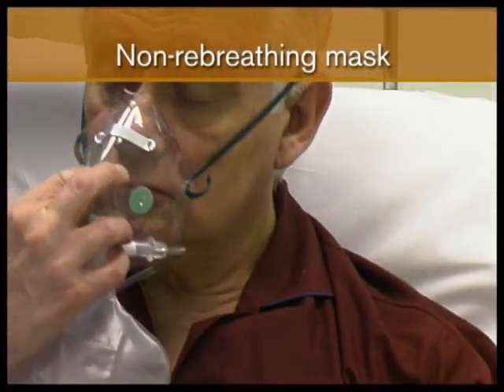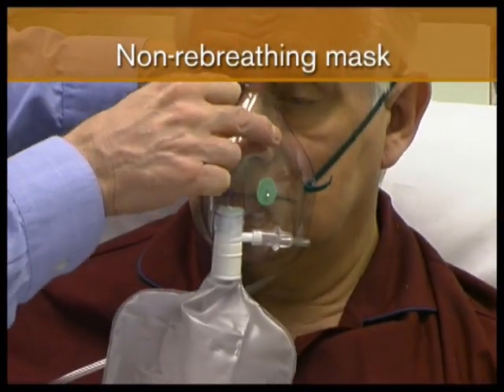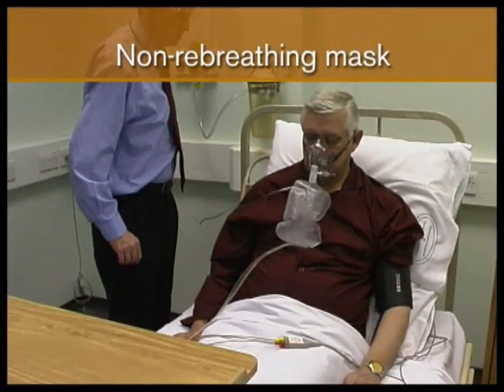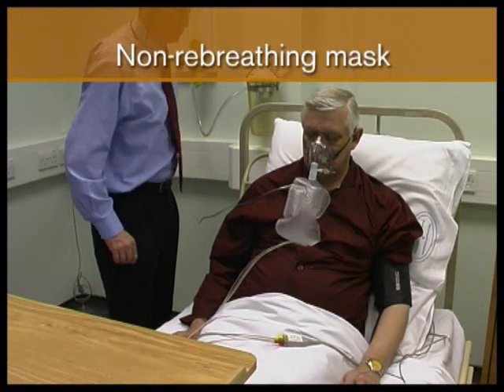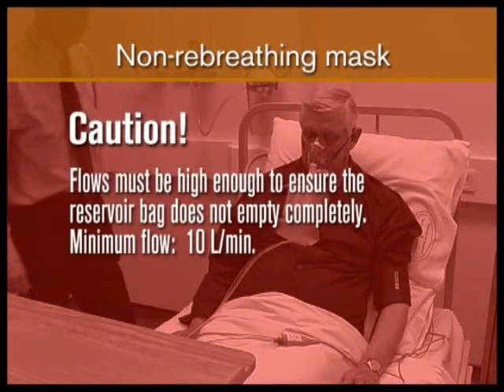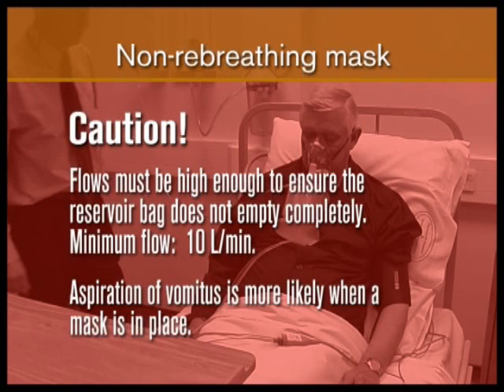Place the mask on the patient's face, obtaining as tight a fit as possible. Adjust the oxygen flow rate so that the bag deflates by about 1/3 with each breath. Caution: flows must always be high enough to ensure that the reservoir bag does not empty completely at the end of inspiration. Minimum flow 10 litres per minute. Aspiration of vomitus is more likely when a mask is in place.